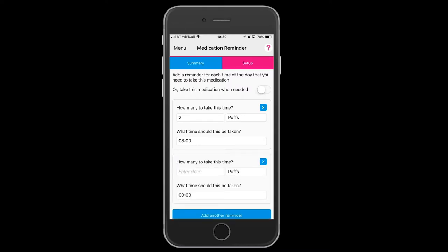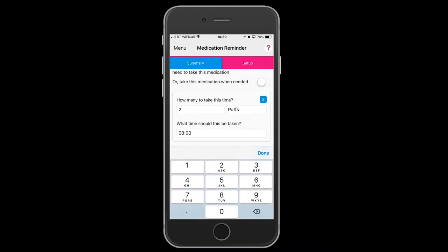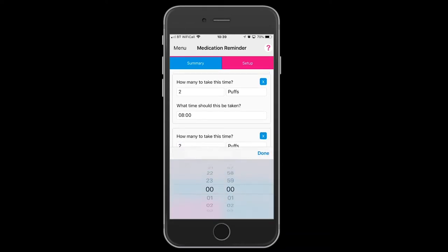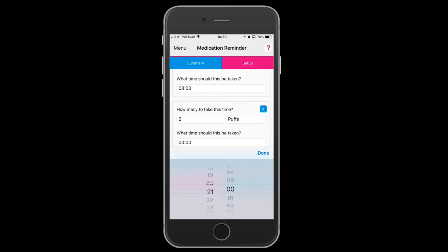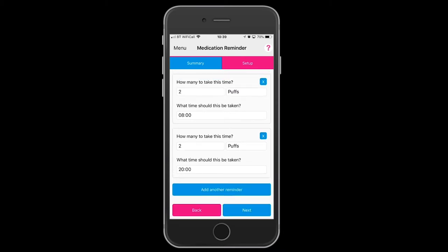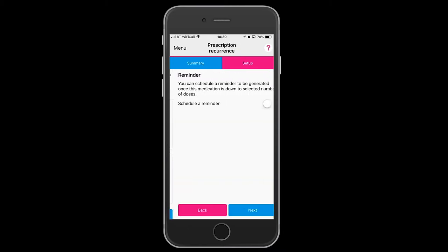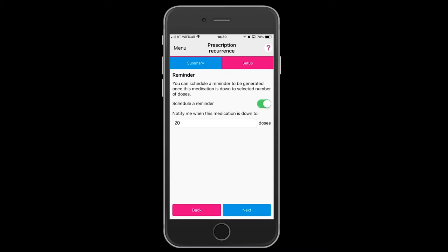You may also need to take this preventer in the evening, so set up a second reminder. Schedule a reminder when your inhaler canister is down to the last 20 doses, or you can change that to whatever number you want.